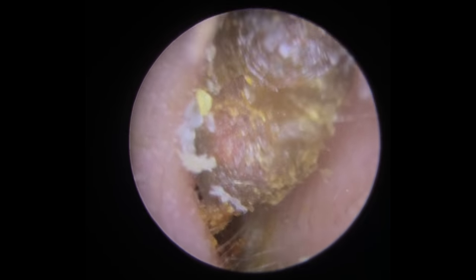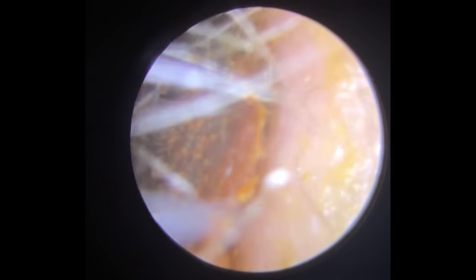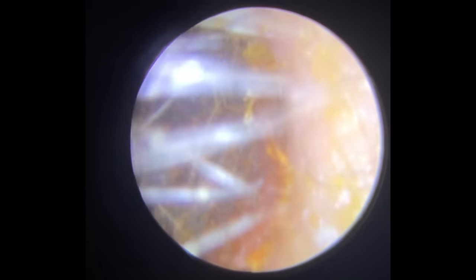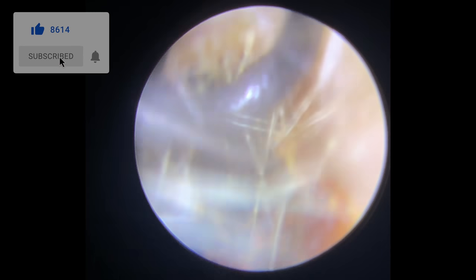These ears are completely chock-a-block front to back, very, very thick and sticky type of ear wax — almost a clay consistency. There are dry skin flakes around the outside edge, which contributes to the dryness of this wax. This patient isn't producing enough oil around the outside part of the ear canal, so the wax can't absorb extra oil to soften before it leaves the canal. It ends up with a very dry, stickier consistency that looks like play-doh or clay, and when that happens it starts to stick to the canal wall and everything backs up behind it.